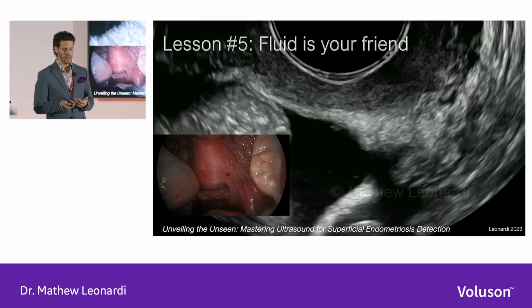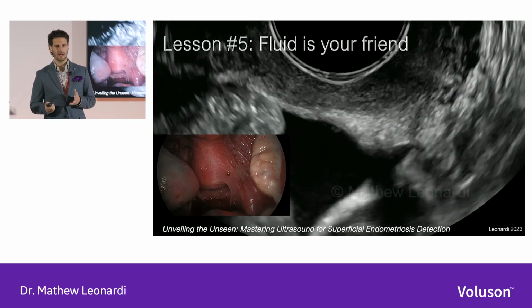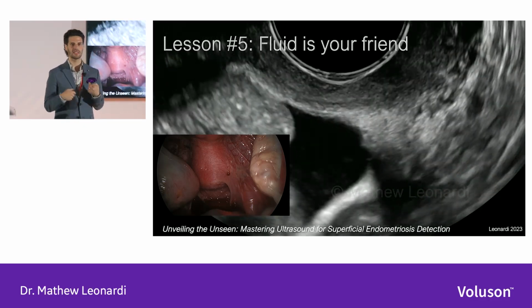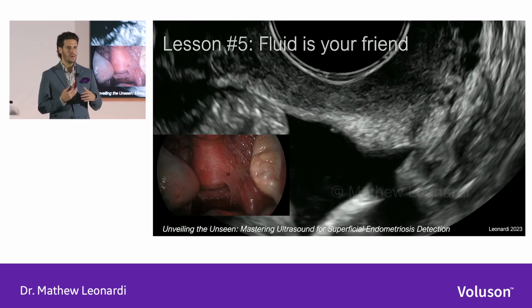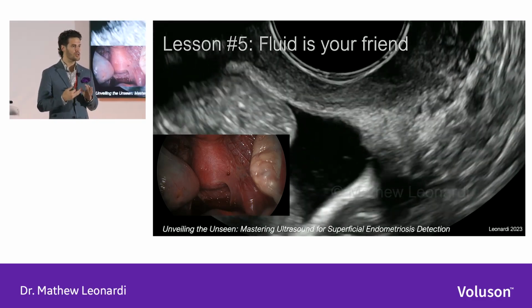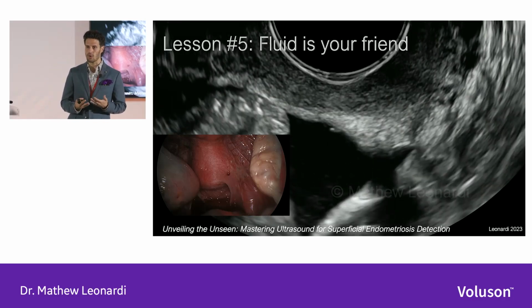So, speaking of fluid, lesson number 5, fluid is your friend. Anytime you see fluid in the pelvis, you should get excited. I get excited when I see fluid in the pelvis because it's an opportunity for me to see things that otherwise would be invisible. And when you have fluid, you have a lot more utility of the dynamic tool of ultrasound, the ability to push and pull, shake things, and you can appreciate these irregularities a lot more clearly.